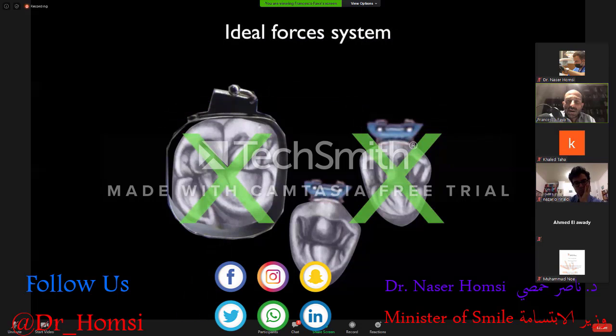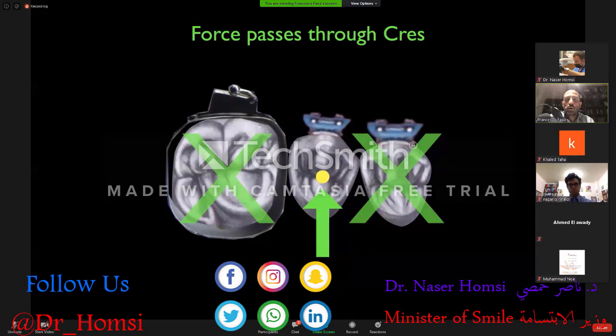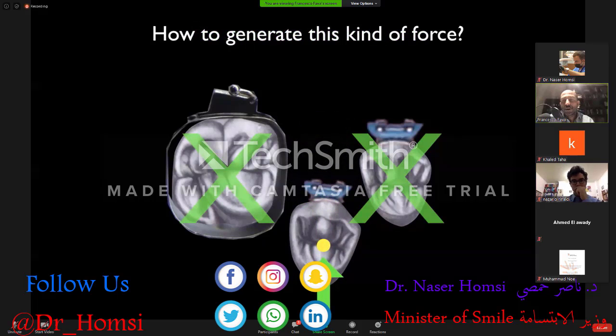Regarding the second premolar that needs to go outward, we could apply, by using the segmentary technique, the ideal force system that makes the tooth go outward, and this is a single force passing through the center of resistance. And this force can be generated in many different ways.